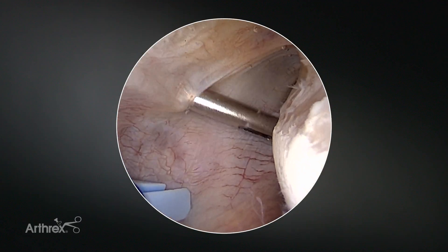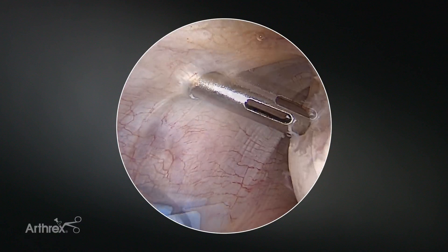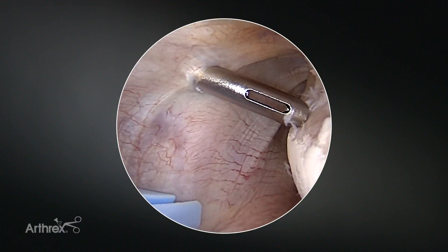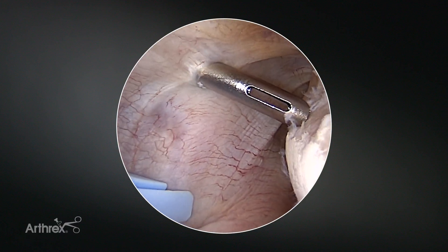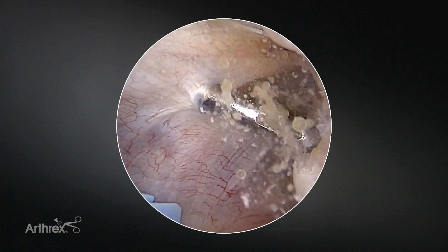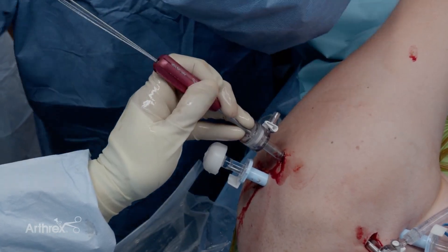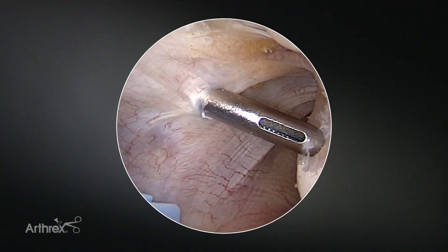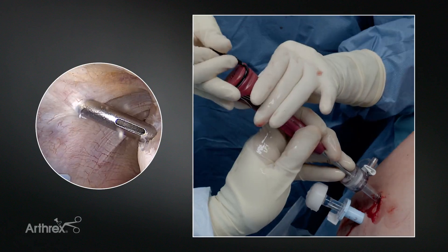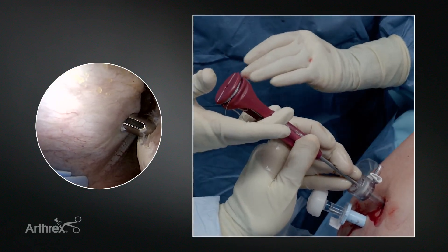I'll remove the trocar of the guide and I'll be just up against the cartilage of the humeral head. If I have a really large defect, sometimes I won't go all the way over to the medial edge of the defect. I typically find that a 1.8 anchor works very well in this location. Prior to removing the guide it's important to push the cannula back down to confirm that you have it just above the posterior capsule.